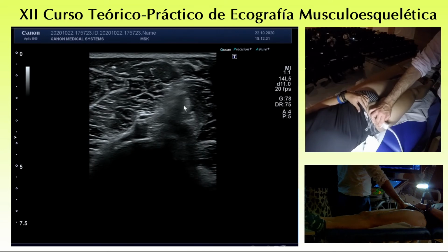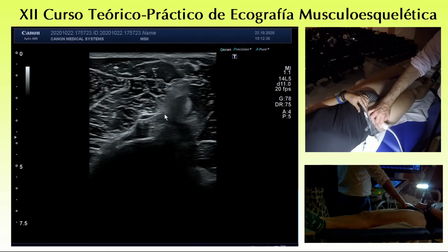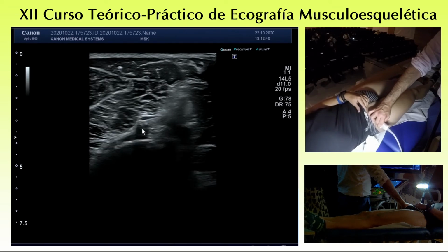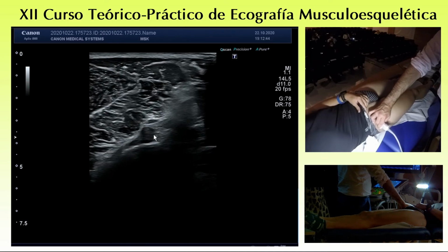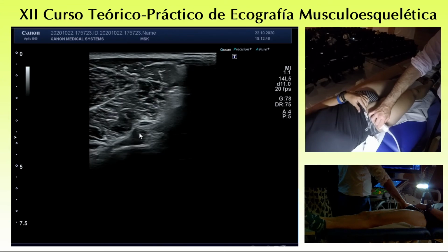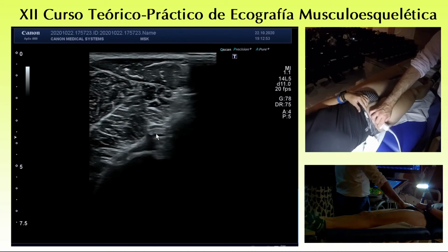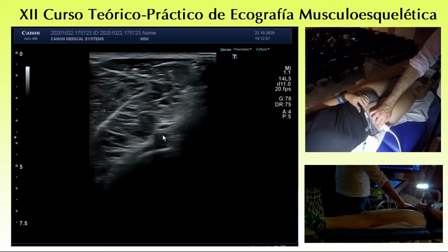Here is the direct part, origin of the indirect. It is an alteration along the indirect tendon. Indirect tendon that could also be some previous injury, like scar tissue. You notice that sometimes when you change position it could be much more useful to enhance some subtle findings.